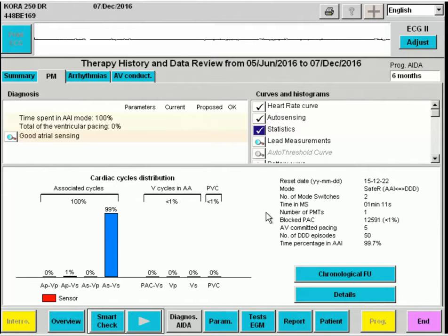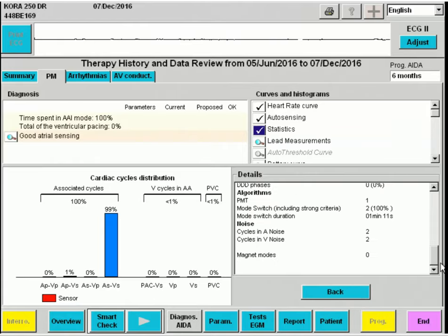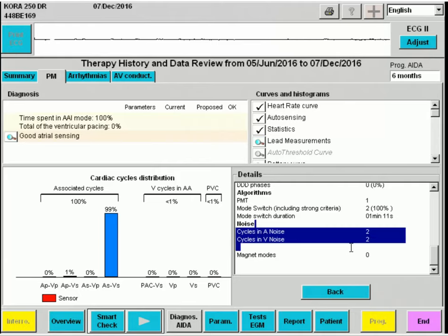Another important element to judge is the quality of the leads. When you select details, we can find noise cycles for the atrium and ventricle. Ideally these numbers are zero, which is almost the case in this patient, so the leads are in good condition.